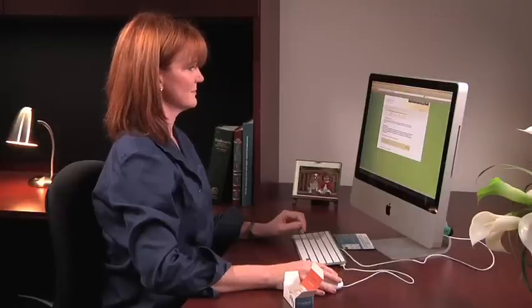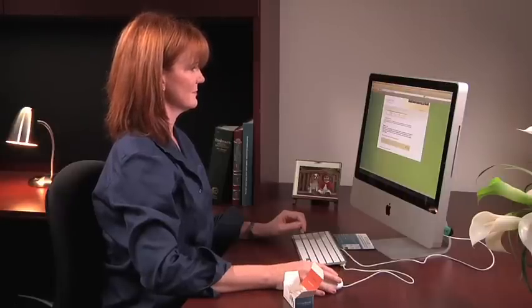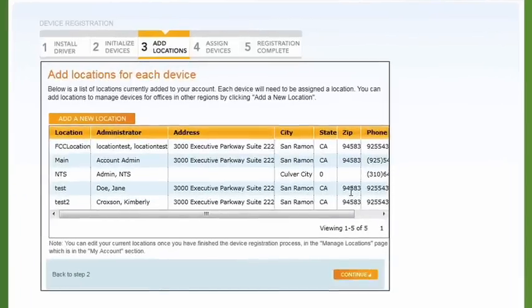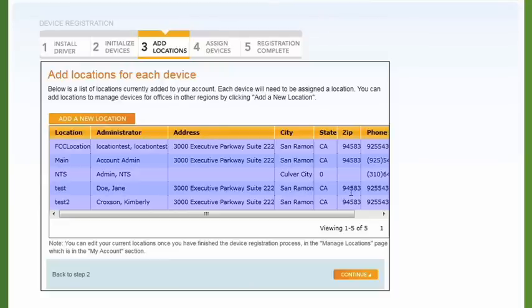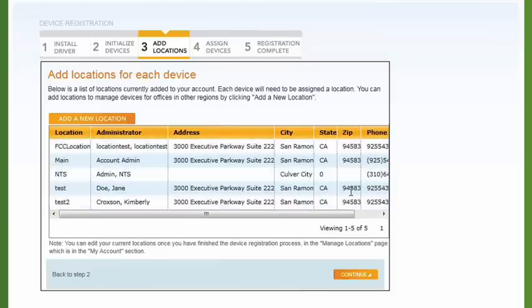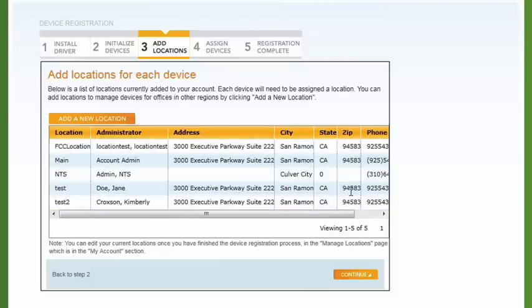When initialization is complete, click Continue. The next step allows you to add locations to your account. The locations currently associated with your account are displayed. You can create a new location to manage devices for offices in other regions by clicking Add a new location. If you don't need to create a new location, click Continue to proceed to Assign Devices.